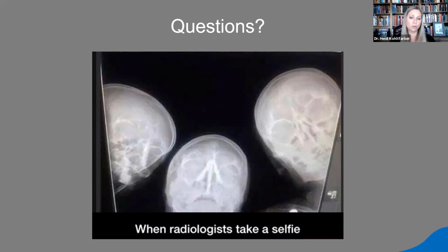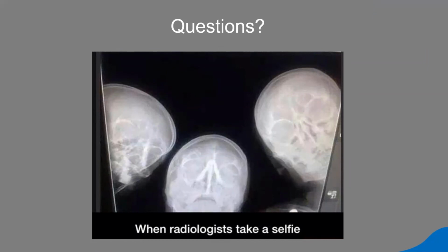Certainly, this is a tool in our toolbox that can aid us in trying to discover what is wrong with our patient. If that patient comes in pain, do we want to have a CBCT? Is that going to tell us more about what's going on? Yes, it is. So we want to take things more on a case-by-case basis. If we want to see exactly what's going on with the osseous structures, then we want a CBCT. But we have to leave that up to the individual judgment of the clinician, so I can't just come out and say something is blanket standard of care.